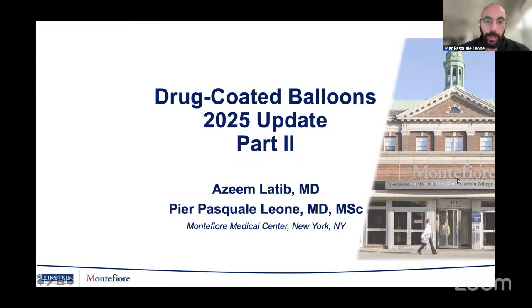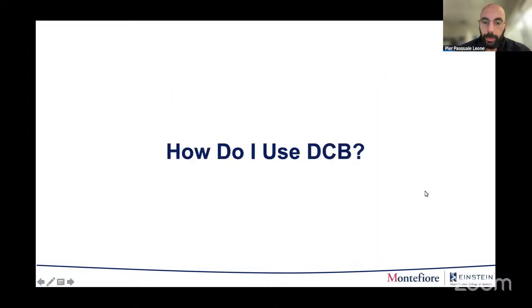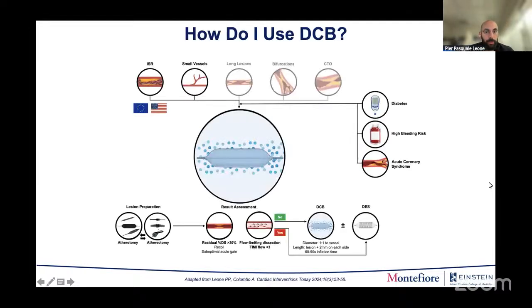Good morning, everyone. I think we can go ahead with the second part of DCBs, and start off with a simple question. So we have a DCB, how do we use it? Number one, it's important to understand when. In terms of clinical and angiographic indications, we have some OGs, like in-stent restenosis, and some that have been mostly appreciated overseas, such as small vessel disease in de novo, and others are coming up.